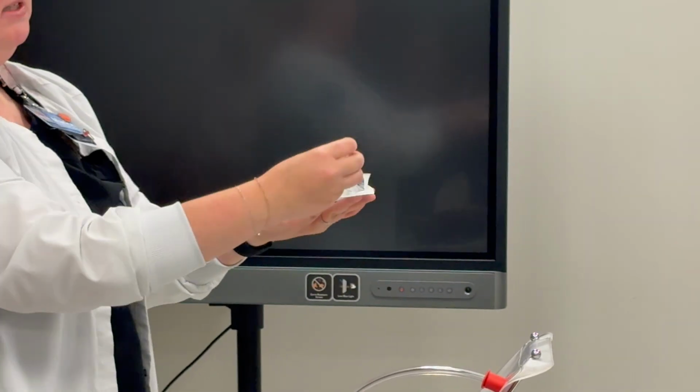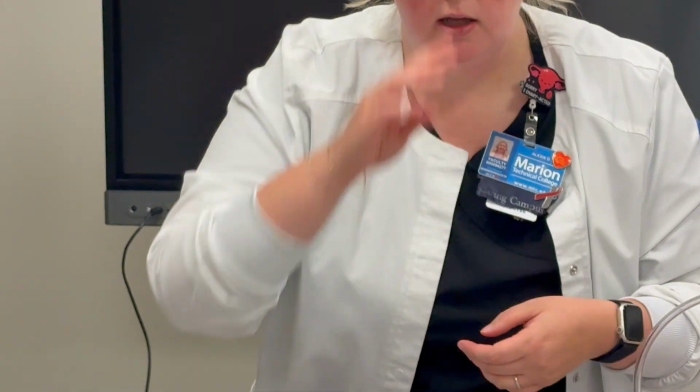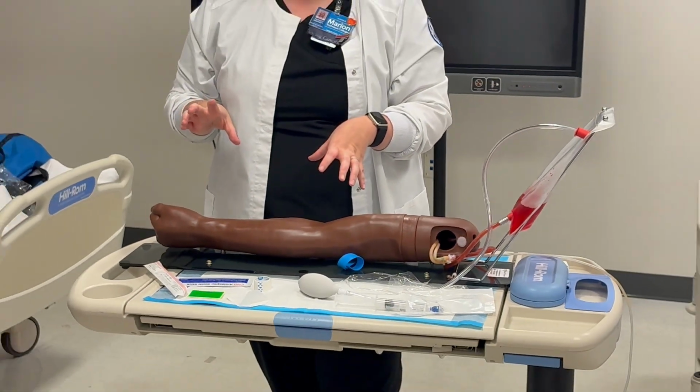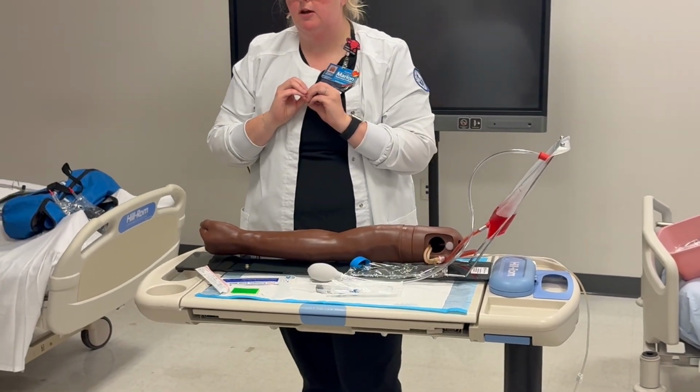out, okay? This is flushed. I'm gonna keep this next to my patient, okay? The reason that we do that ahead of time is your hand is gonna be busy, and I'll show you here in a minute, okay? So we wanna get all of our stuff kind of set up. Does anybody have any questions about that process?